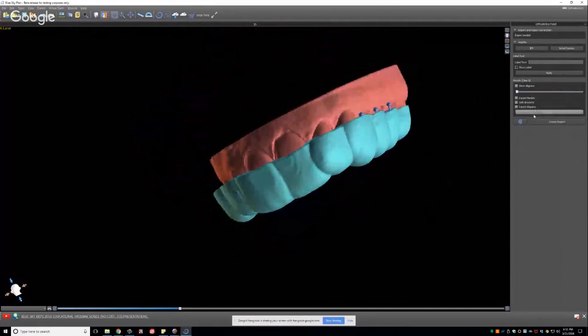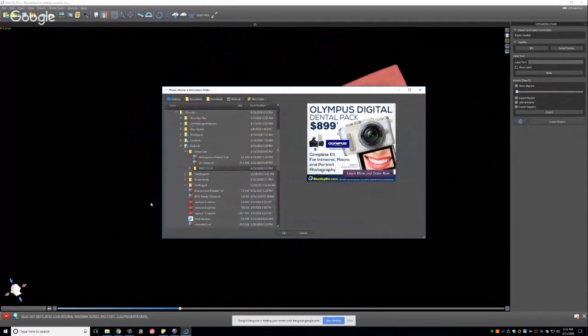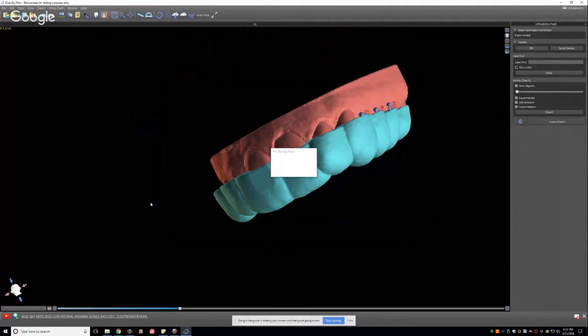Are there any other questions, Michael? Yeah. Can we close spacing, like closing a diastema? Yeah. So yes. So closing diastemas is challenging with aligners. Far more challenging than brackets. So what does that mean, and how do you make it happen?